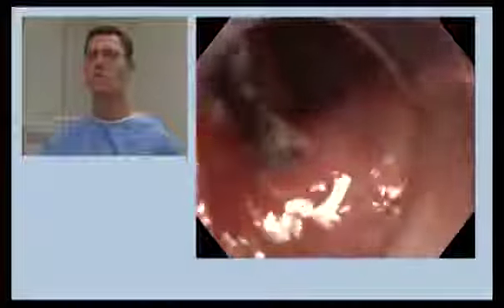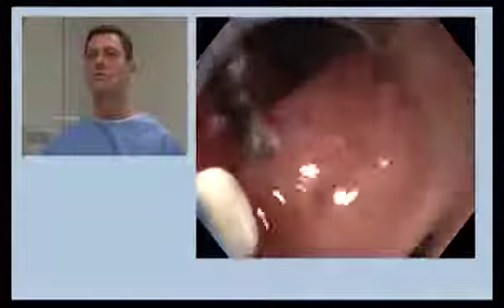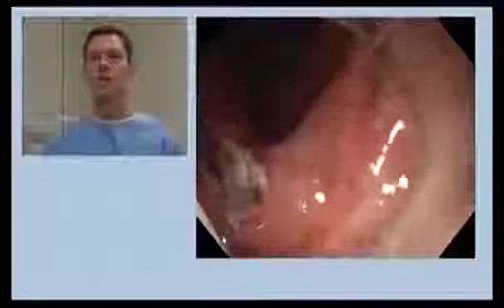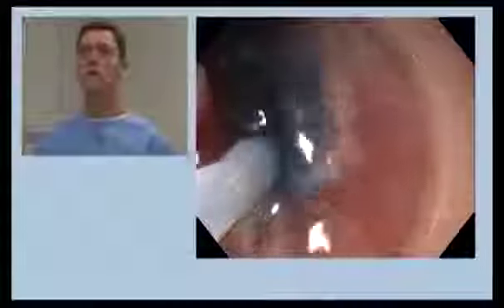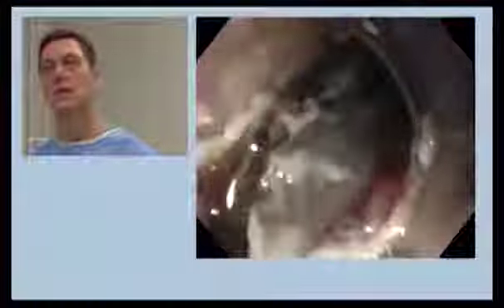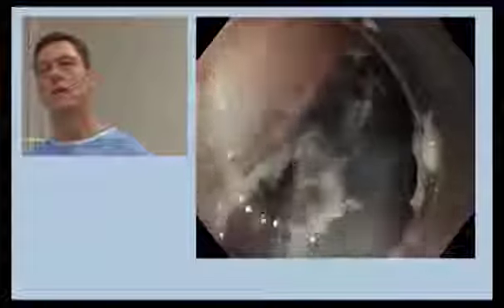We'll take a special knife here. It's the Dual J knife from Olympus. It's designed so you can both cut with it and also use it for injection. So now we're extending it. Inject. And you can see how rigid it is here as well. I'll withdraw it and we'll show you it briefly. Now we've got, on the side here, it's lifting much better.